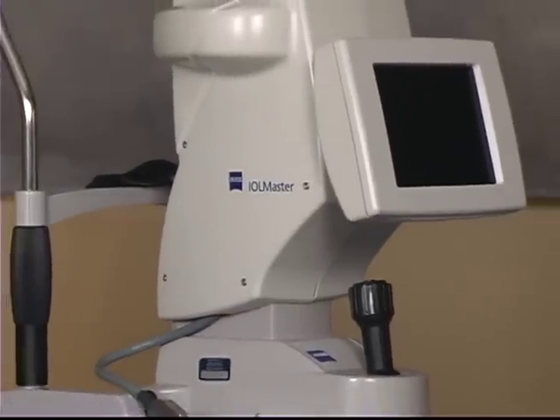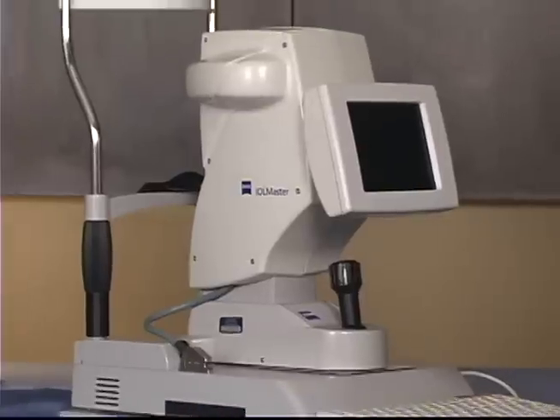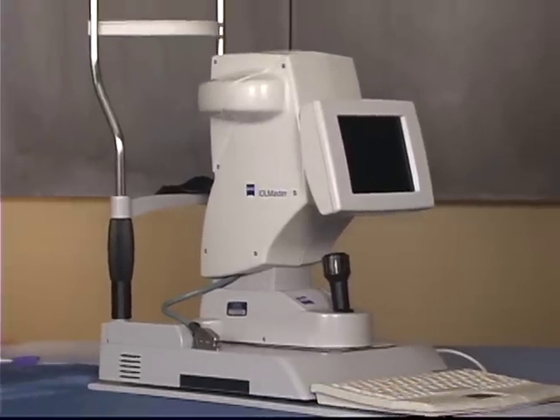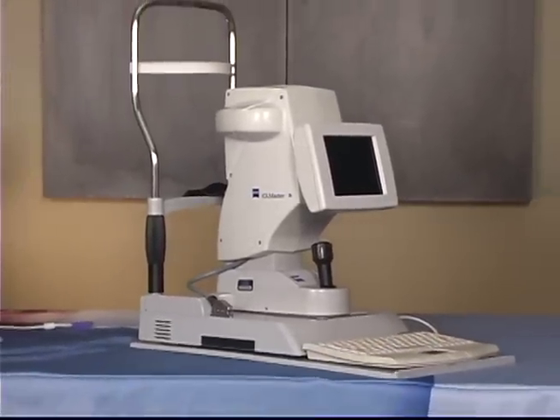The IOL Master is a non-contact optical device that accurately measures the eye length and surface curvature, which is necessary for cataract surgery.